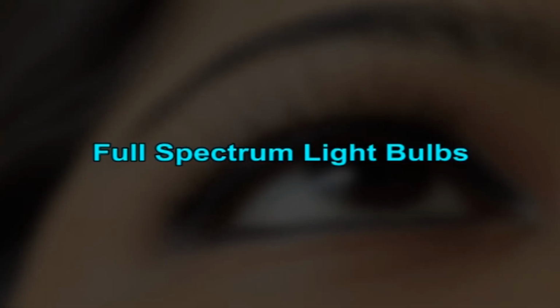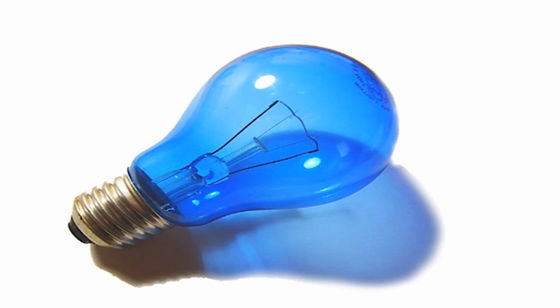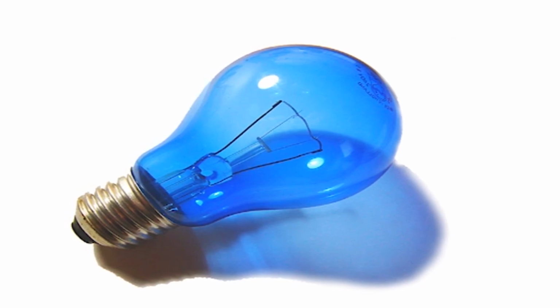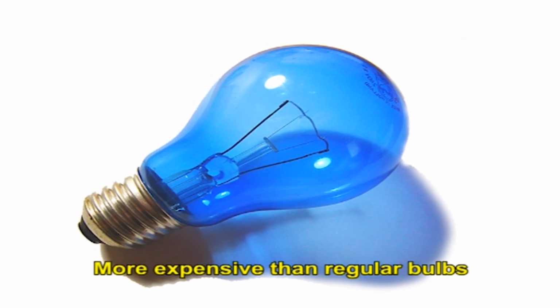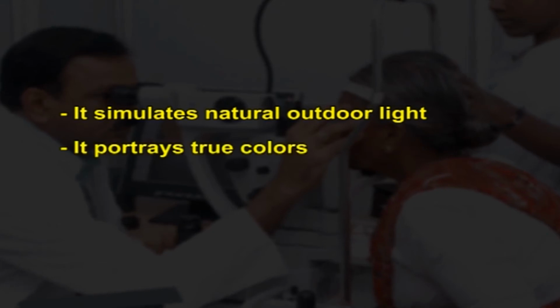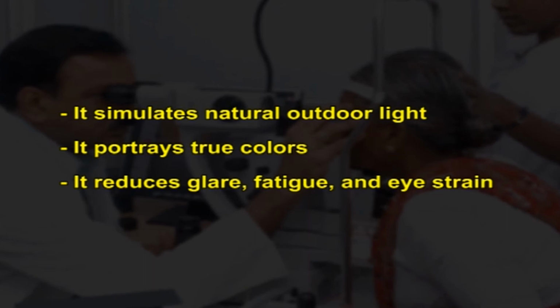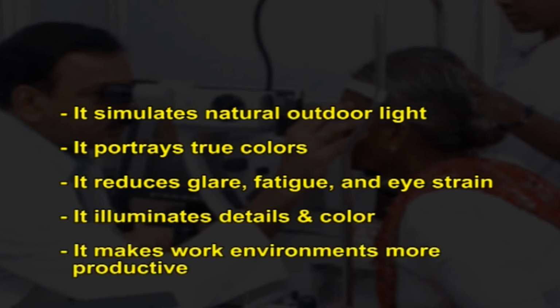Full spectrum light bulbs. Full spectrum light bulbs provide the full range of colors found in sunlight but are more expensive than regular bulbs. Some of the uses are it simulates natural outdoor light, it portrays true colors, it reduces glare, fatigue and eye strain. It illuminates details and color. It makes work environments more productive.